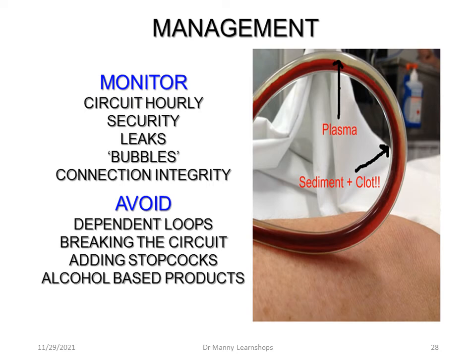Management: monitoring closely. Observe for leaks, bubbles, connection integrity. Avoid dependent loops, breaking the circuit, adding additional stopcocks or additions to the circuit. Avoid alcohol-based products. It can affect the integrity of the circuit.